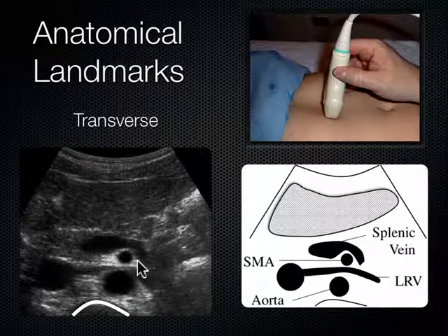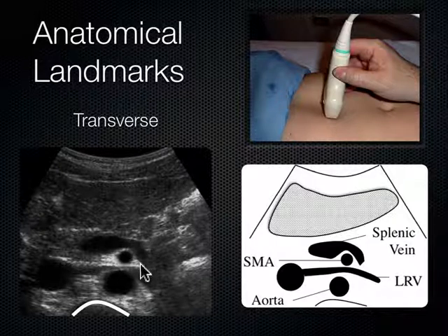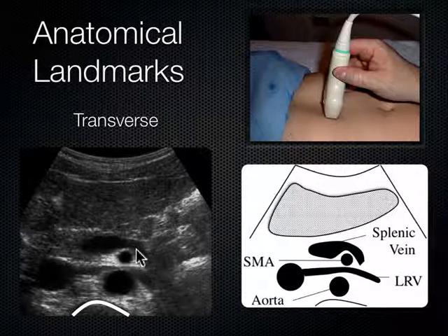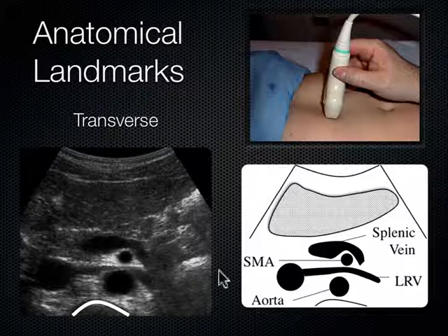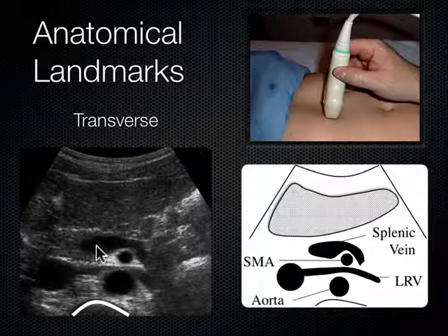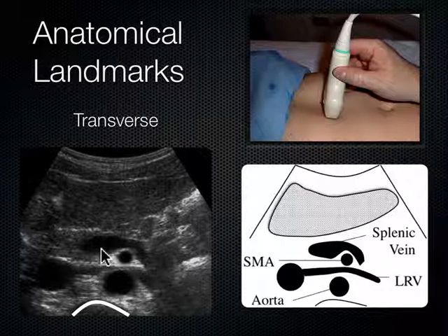You haven't had anatomy yet, but you'll learn it eventually — you may as well get a taste of it. This is the superior mesenteric artery, which I think looks like a mantle clock. There's an anechoic structure crawling over the SMA — that's the splenic vein, taking blood from the spleen and eventually combining with the superior mesenteric vein to make the portal vein, which empties into and gets filtered by the liver. Outside the splenic vein is the pancreas, and above that is the liver.